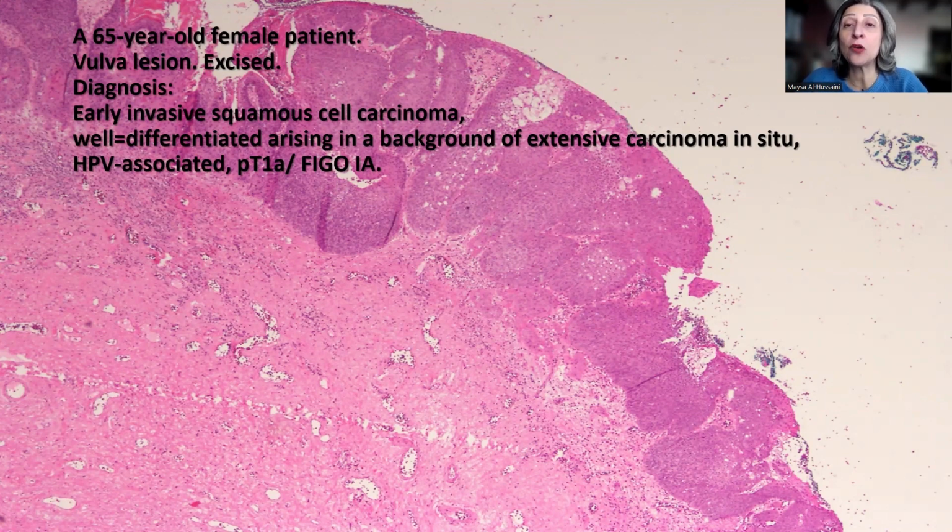This is known as paradoxical maturation, a very useful sign of early invasive squamous cell carcinoma.